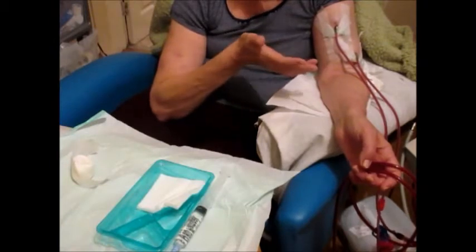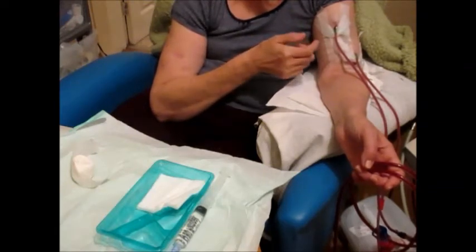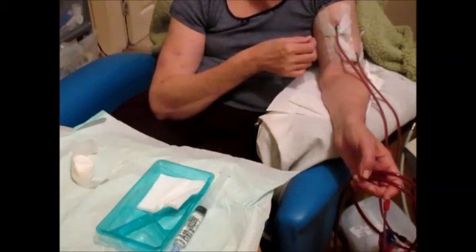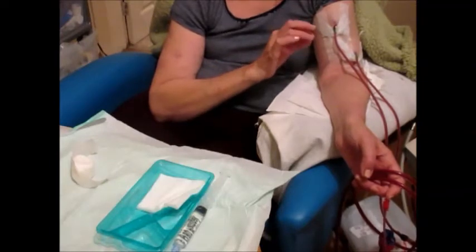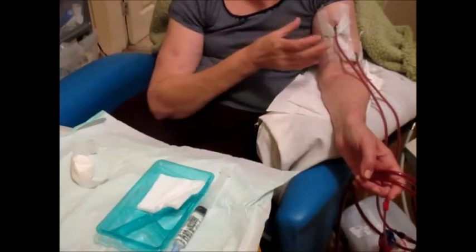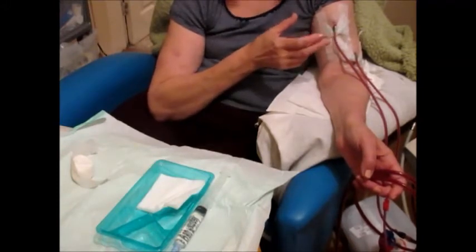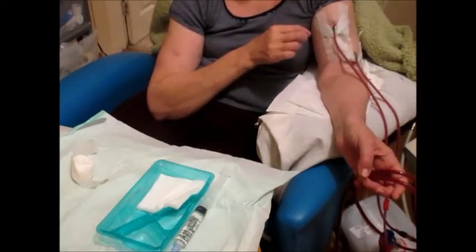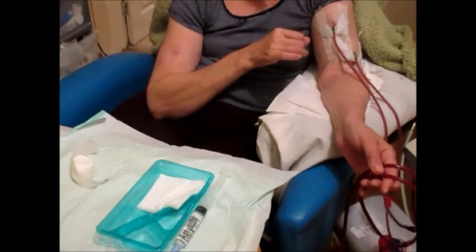The other thing I forgot to mention is that I don't tend to use a tourniquet because it's difficult with one hand to release the tourniquet and insert the needle. But those on maintenance dialysis preferably should have a tourniquet, because as well as helping to locate the blood vessel and enabling you to palpate it better, it also stabilises the vessel and makes it less likely for the fistula to move around during needle insertion.